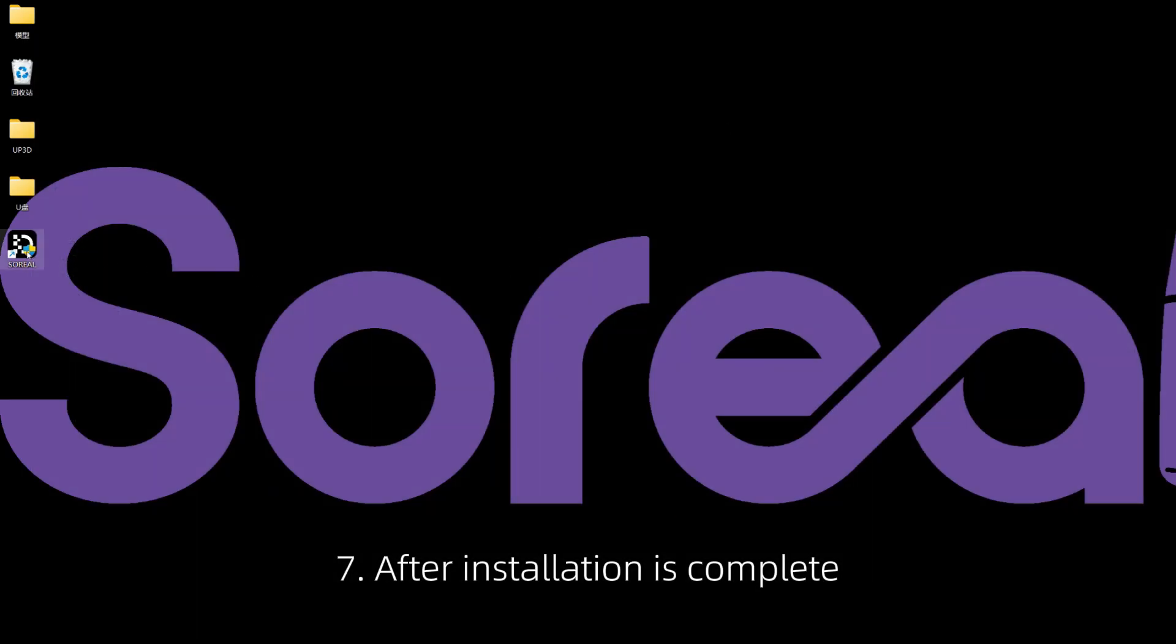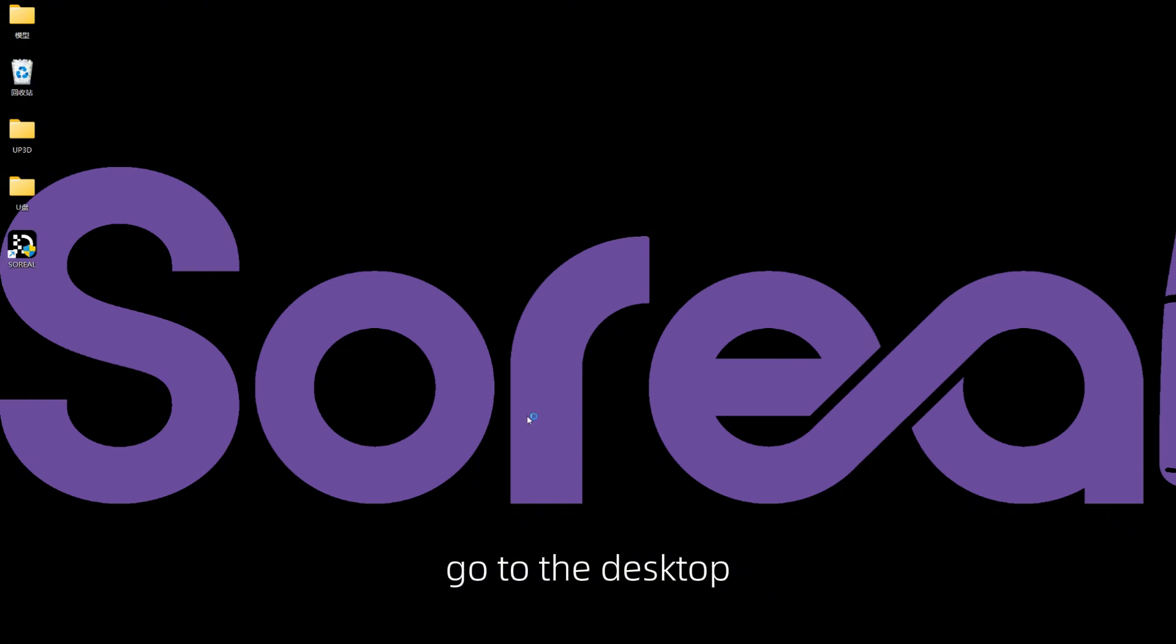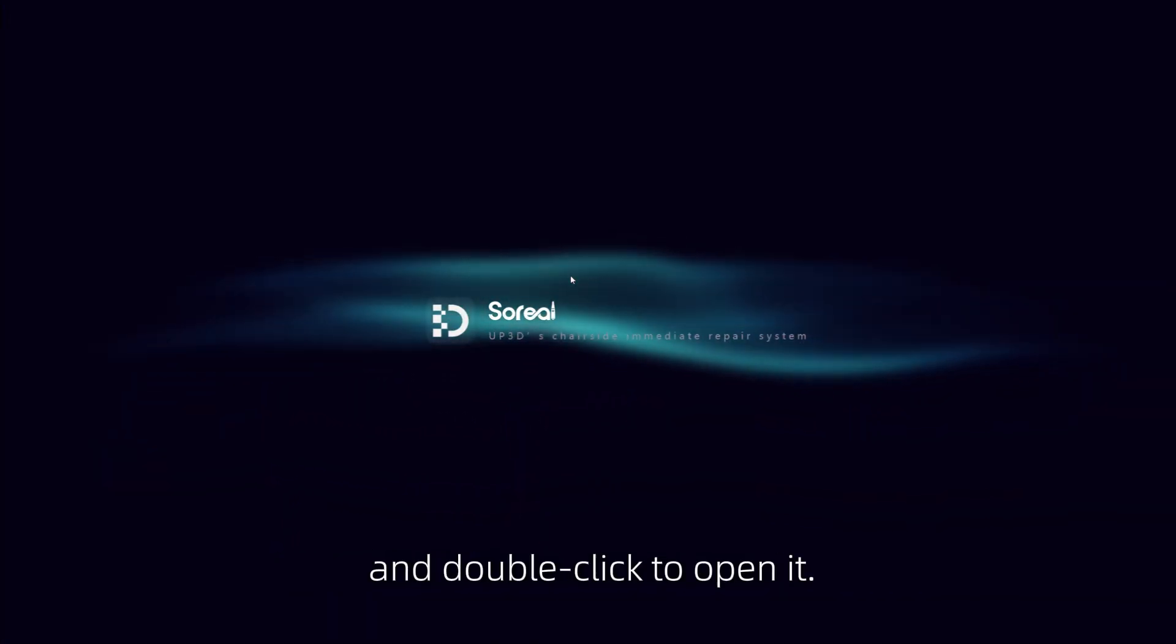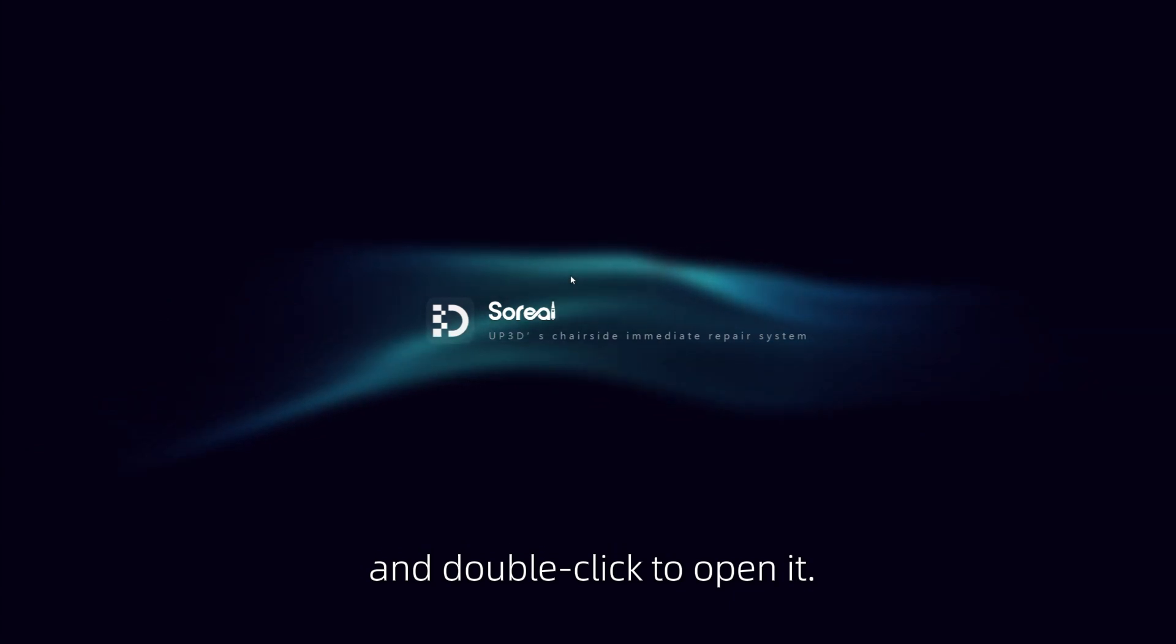After installation is complete, go to the desktop, locate the software icon named SOREAL, and double-click to open it.